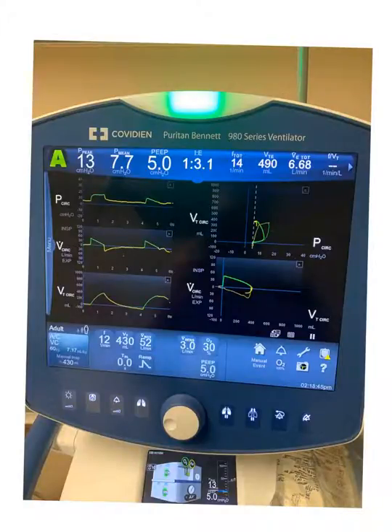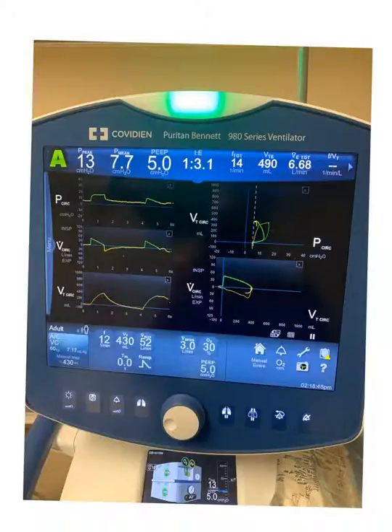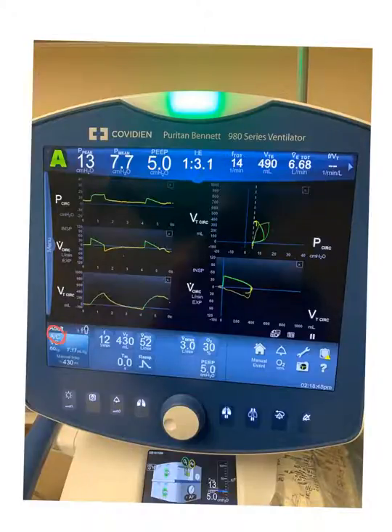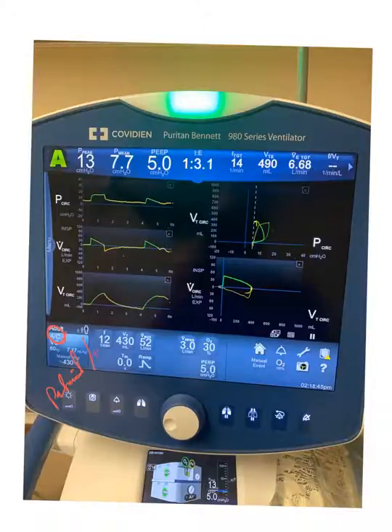I want to demonstrate the trigger for you on this ventilator screen. Ventilators can have different screens, but at the end they have the same information. You can see here 'AC' — the AC here means assist and control breath, so there is both patient and ventilator triggers.